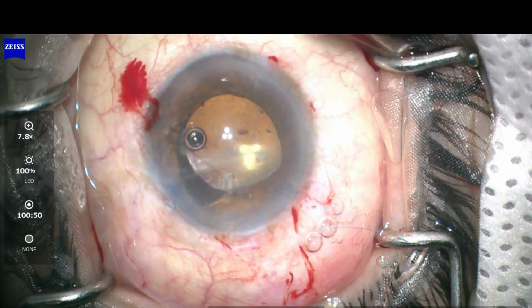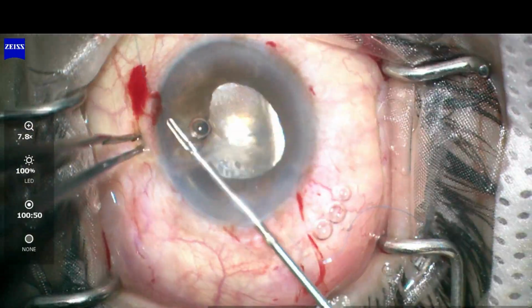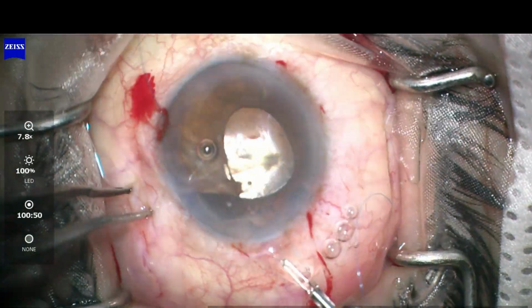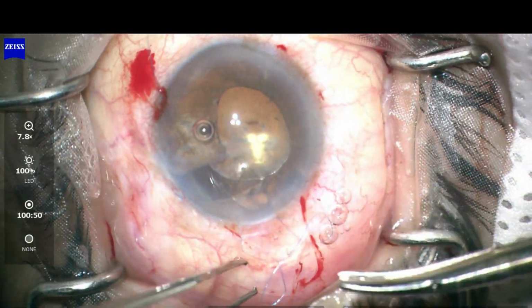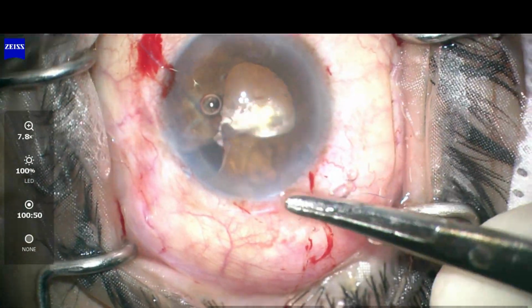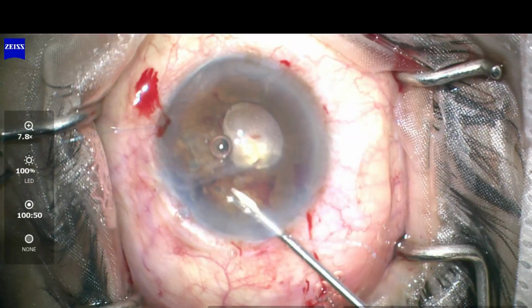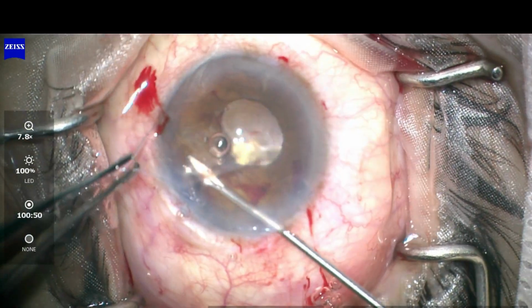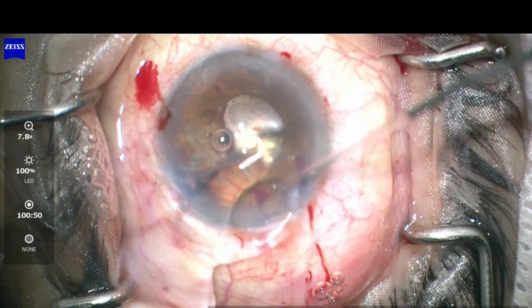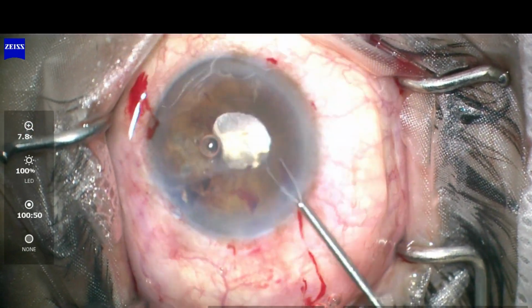where using a 26 gauge needle I am hooking one margin of the iris and the Prolene suture from the other end. Once a loop is formed inside the anterior chamber, it is being exteriorized and 4 knots are being made and pulled in from both ends. Now I am cutting the sutures. Likewise I am making 2 more sutures to close the iris defect.